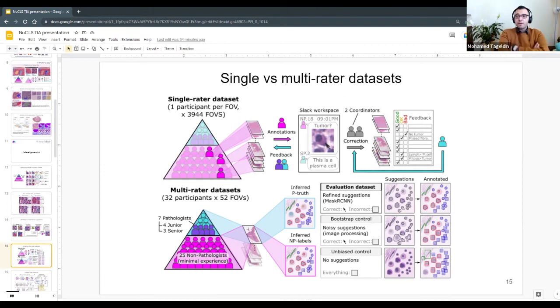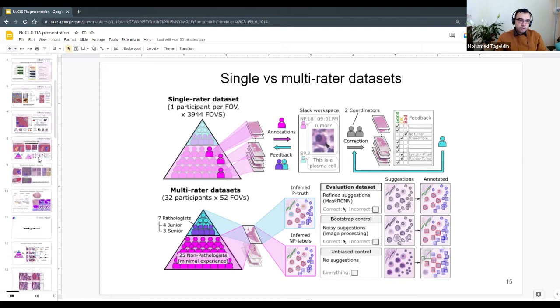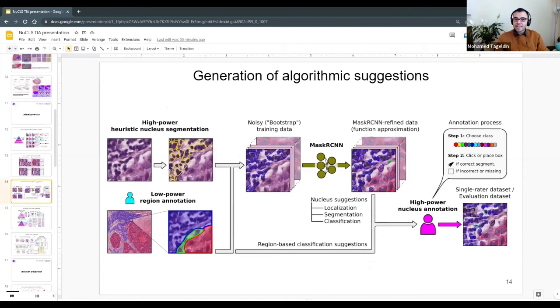Yeah, no, absolutely. If I were to do a second project where I want to annotate a different data set, the initialization process here, the main purpose of this is to generate data for sure, but a big chunk of what we're doing is a validation study really of the process. So using something that is a little bit on the less accurate or on the more difficult end is part of the process itself. It's part of what we're trying to show. In future projects, I would say, we should absolutely use something like NuCLS and even improve the segmentations that we initialize with.